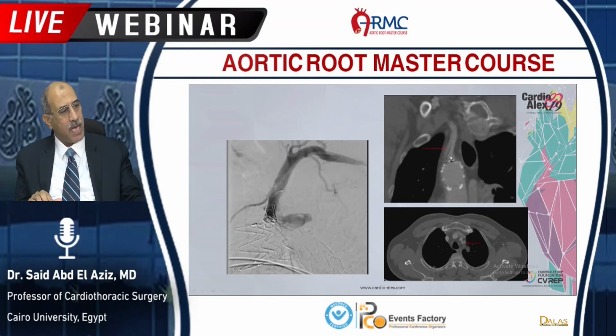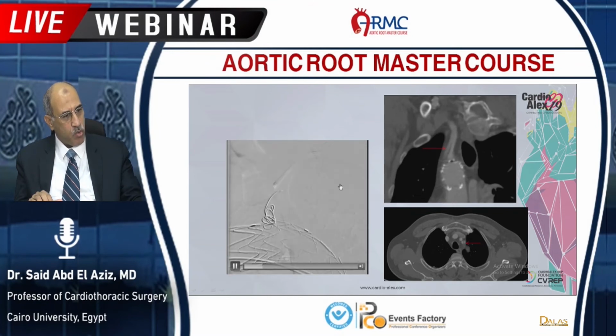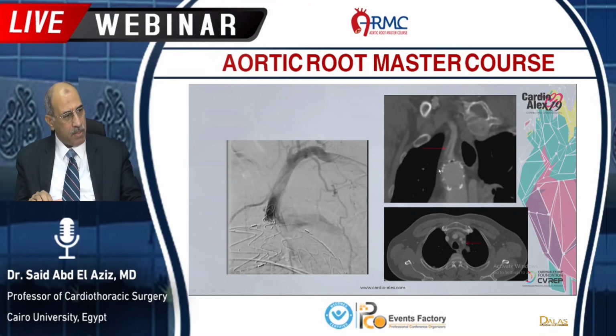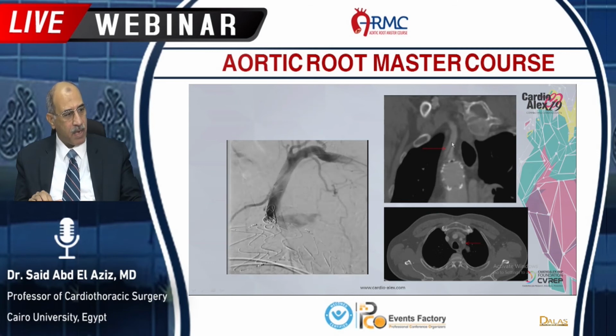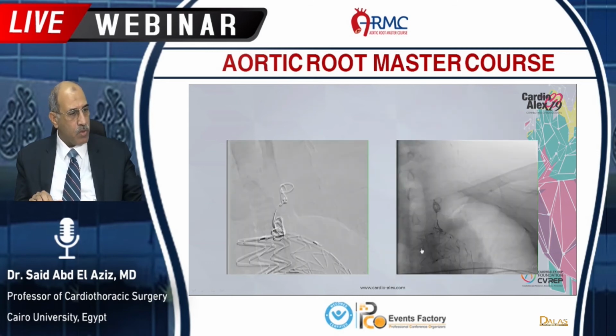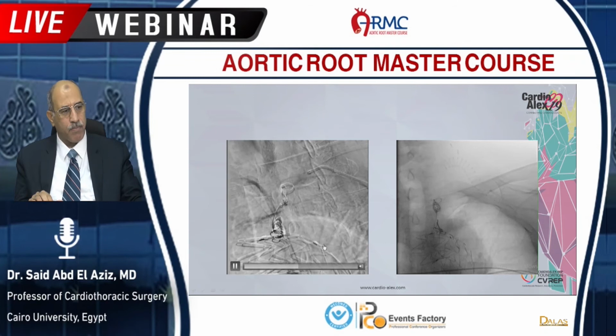Because the subclavian artery is dissected itself, and there is an entry tear in the subclavian artery. So we put the coil here in the mainstream of the subclavian artery, but we didn't occlude the tear. So we put another coil at a higher level to occlude the beginning of the tear, and after we inject, it prevents the secondary endoleak.